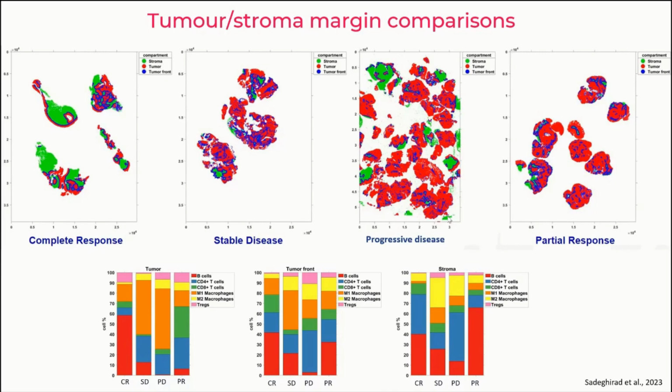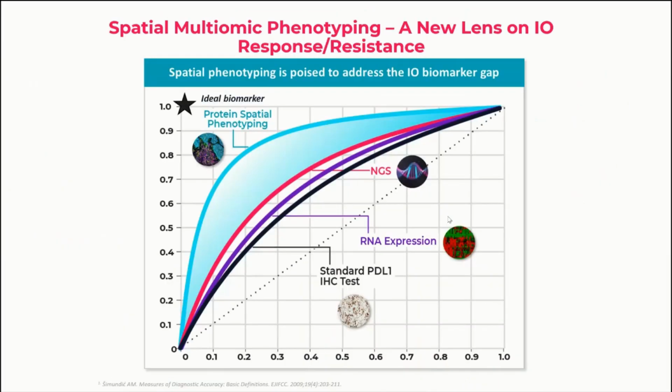That does become quite challenging when you're comparing across slides, and then there are technical challenges. But I think you really need to see the whole tissue to be able to understand the underlying biology that dictates response and resistance to therapy.